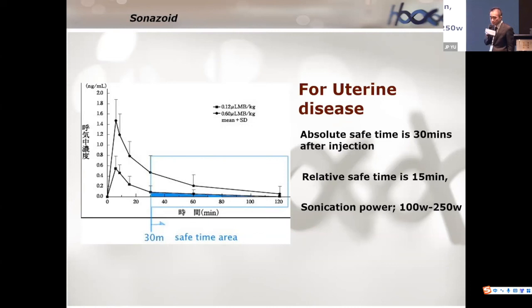One more question. When you start ablating a fibroid, how do you increase your power? Do you start with 50 and then move on to 75 and 100, or do you start with 100, or do you depend on your grayscale change?